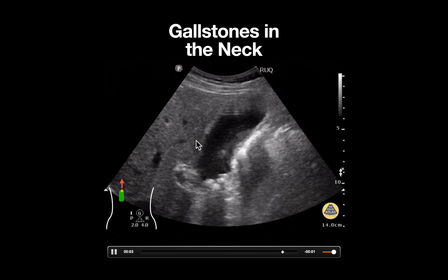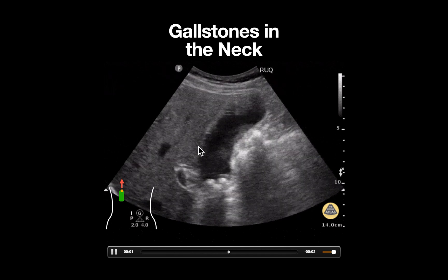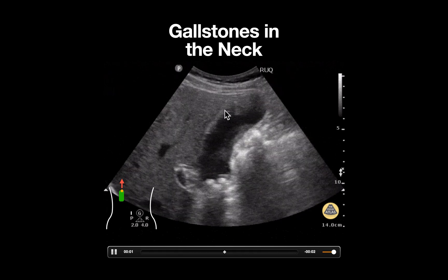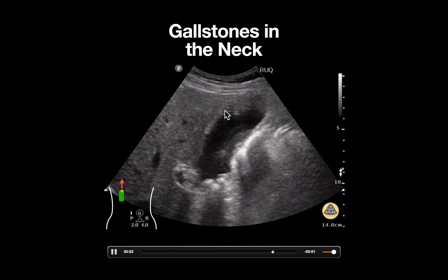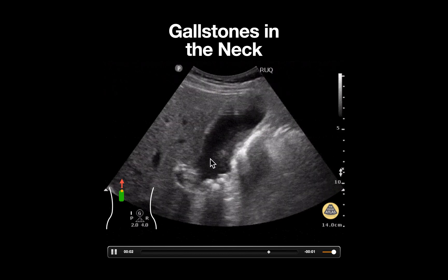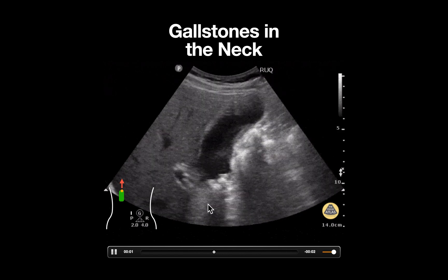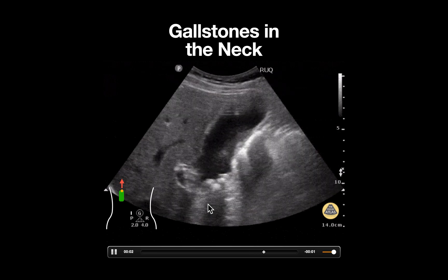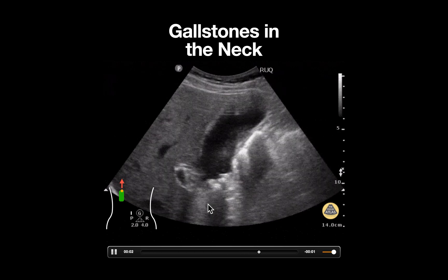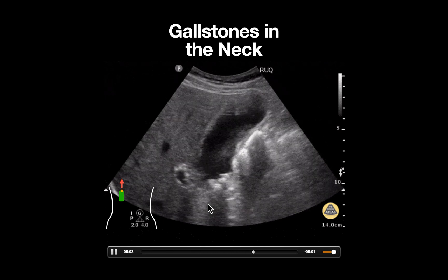Moving our eyes to the gallbladder wall, it appears thin and very homogeneous, and there is no evidence of pericholecystic fluid. This ultrasound image, in conjunction with a patient presenting with acute abdominal pain and a negative sonographic Murphy sign, would suggest a diagnosis of acute biliary colic.